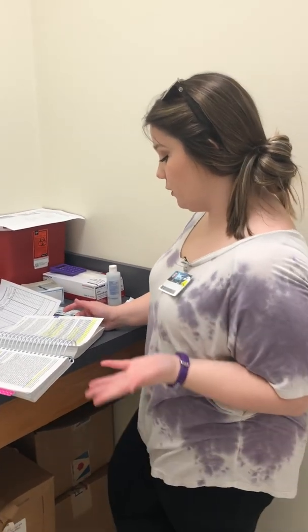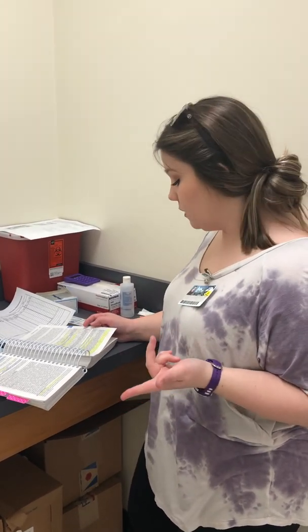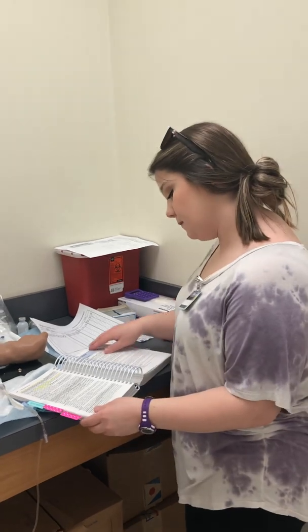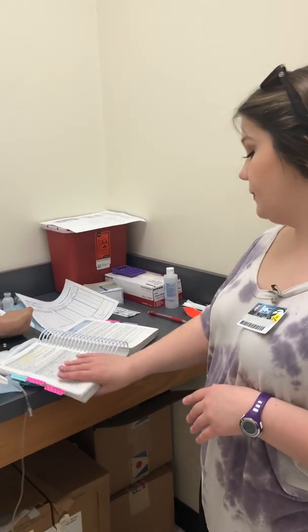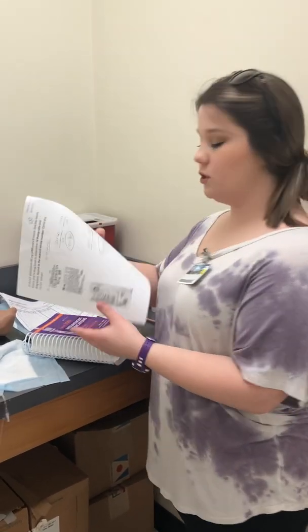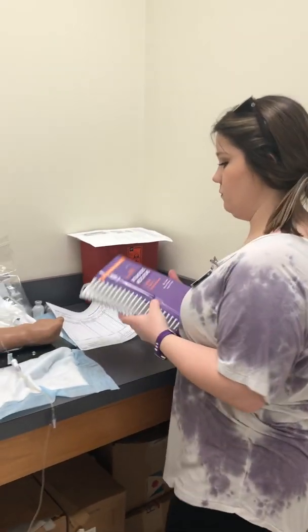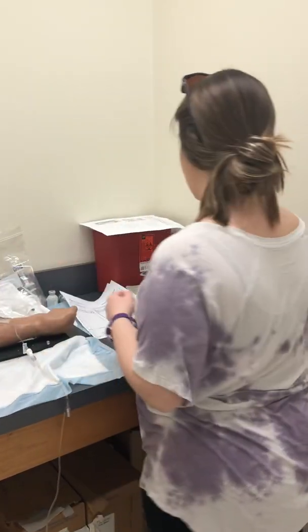I'm going to monitor their peak and trough levels, BUN and creatinine, their electrolytes, calcium, sodium, potassium, things like that. I'm going to tell them to report any dizziness, diarrhea, or any muscle spasms or weakness and fatigue. Okay? Now that I know it's a safe dose and it's diluted correctly, and the rate is right and it's compatible, I've already done my drug problem and I come out with 8 drops per minute. Okay.